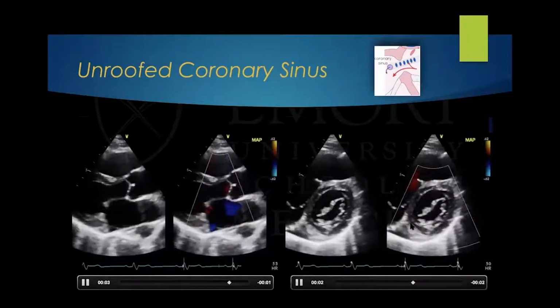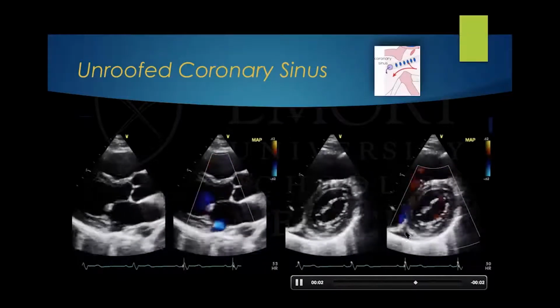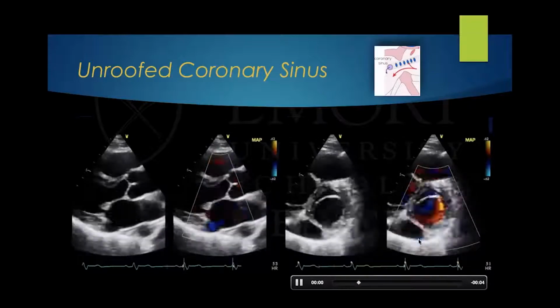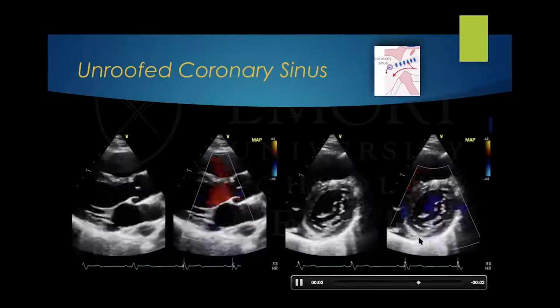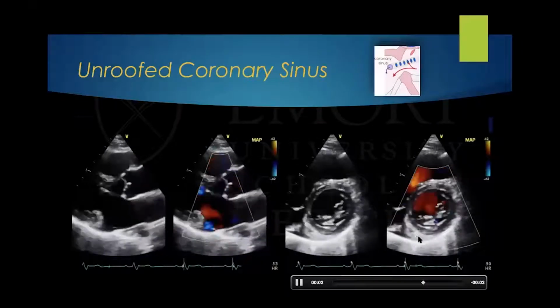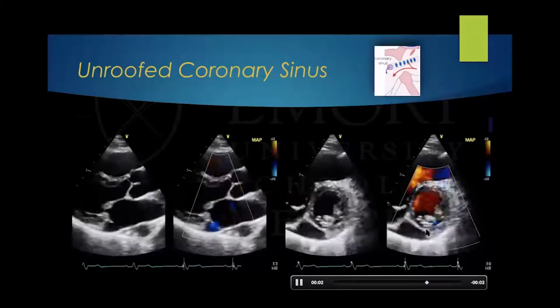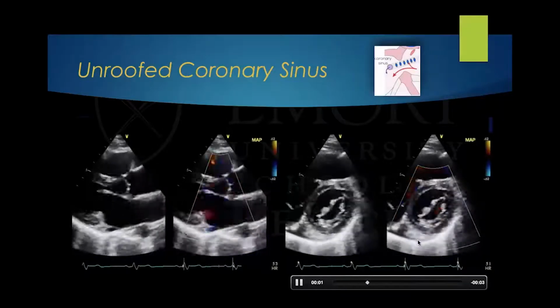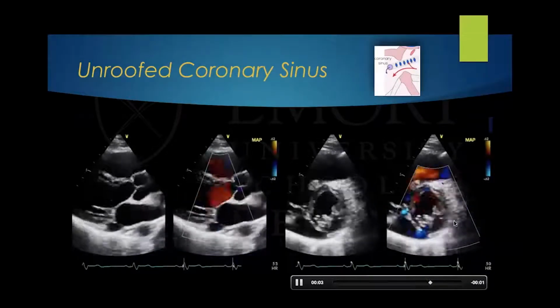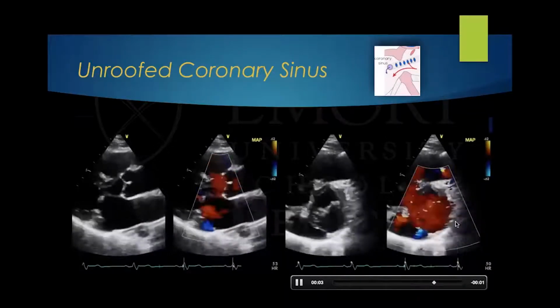In this short axis view, as I move up towards the groove of the heart, here is where the coronary sinus will come into the right atrium, but you see that there is a type of defect, a very unusual flow, blue flow from the left atrium into the coronary sinus. This atrium, there's a right ventricle also appears mildly dilated.